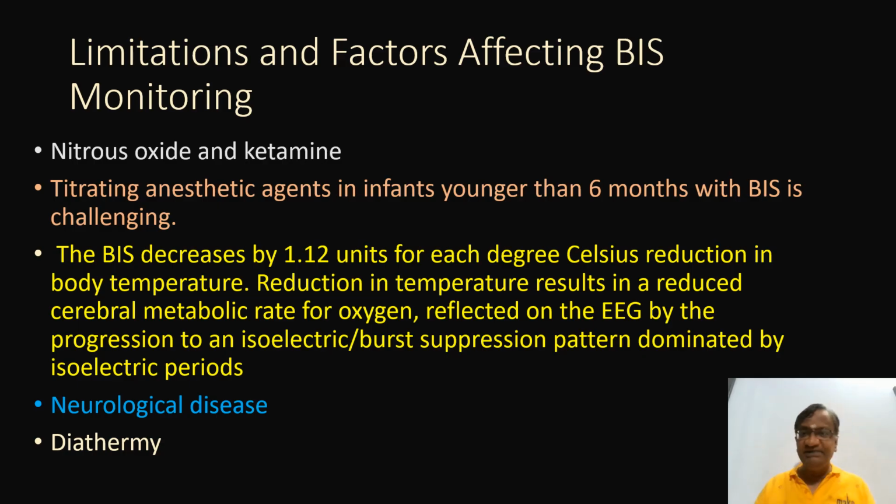Neurological diseases: the patient is already epileptic with EEG changes. Surgical diathermy is a problem, so monitoring during surgical diathermy is a problem. So these are all the problems and limiting factors with regard to BIS monitoring.